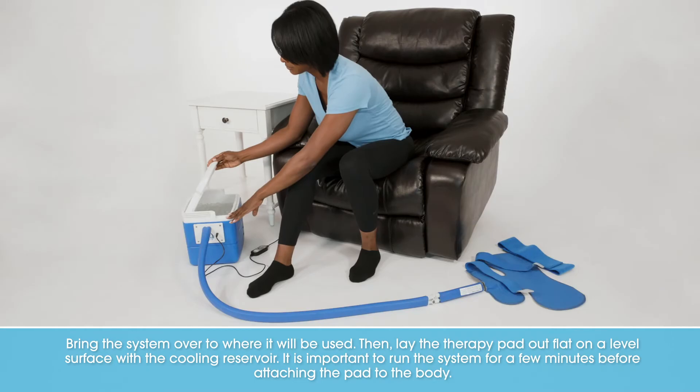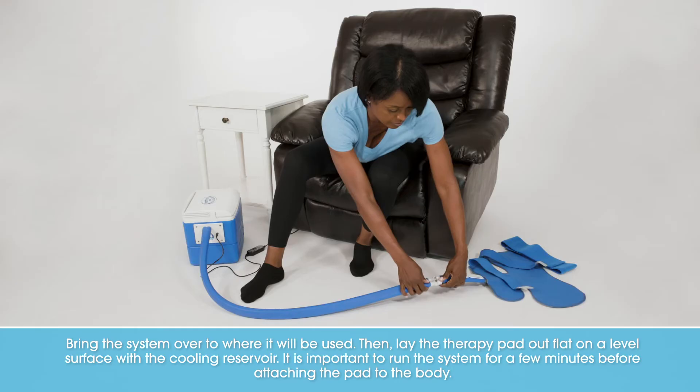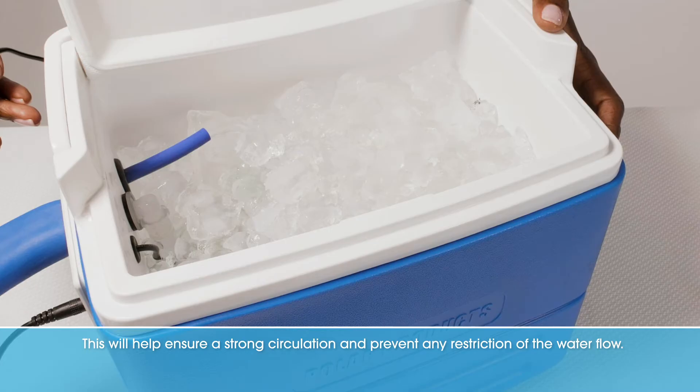Bring the system over to where it will be used. Then lay the therapy pad out flat on a level surface with the cooling reservoir. It is important to run the system for a few minutes before attaching the pad to the body. This will help ensure a strong circulation and prevent any restriction of the water flow.